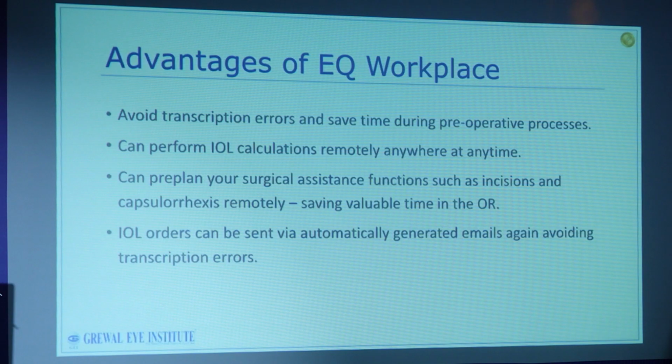You don't have to re-enter the information again and again. You can have an app which will help. You discuss with the patient that, okay, this is the IOL that we are considering. The patient opens up the app. The patient can read all about the IOL, the different negatives, the different positives, and make a much more educated decision. And then all this data is automatically sent to your OR. You can visualize this when you're operating.